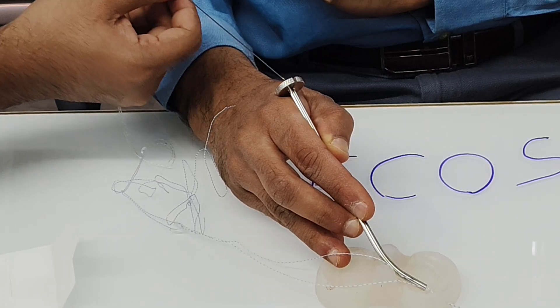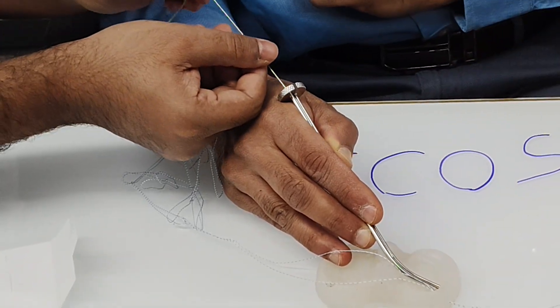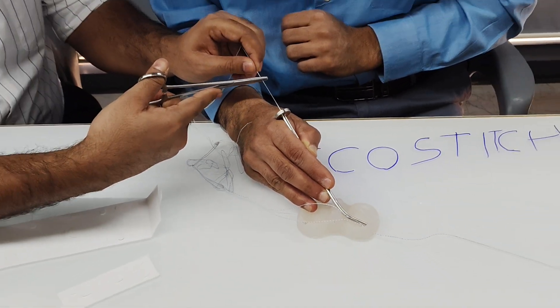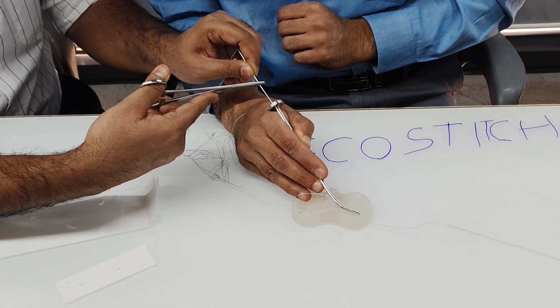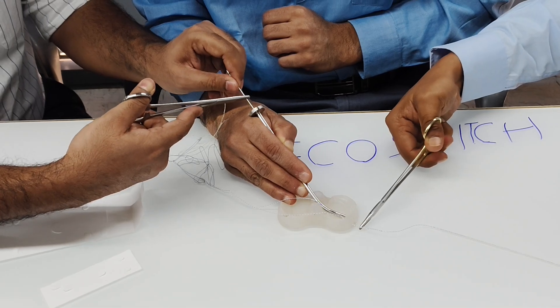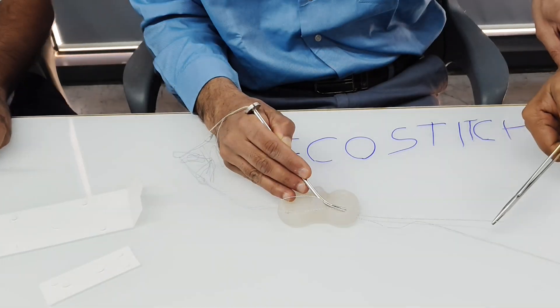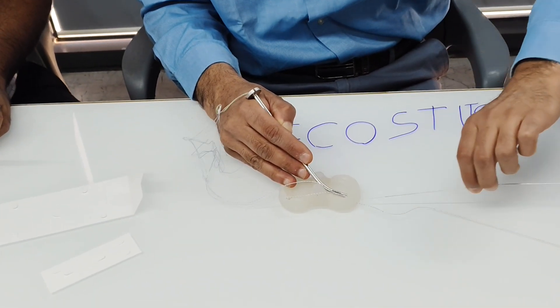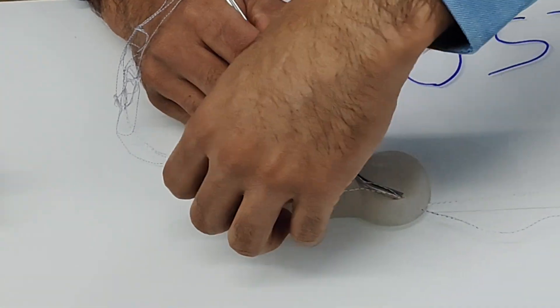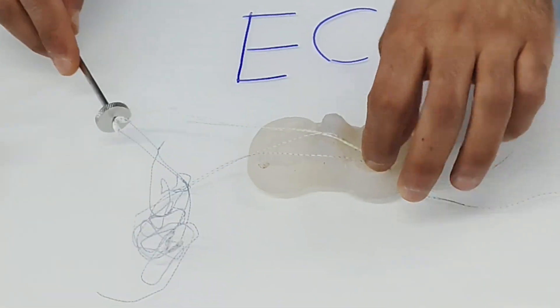Then you pass the second needle from here. Push it in. Ask the second assistant to pull it until the thread is seen outside the skin. Once both needles are in, you can just take out the slotted cannula.